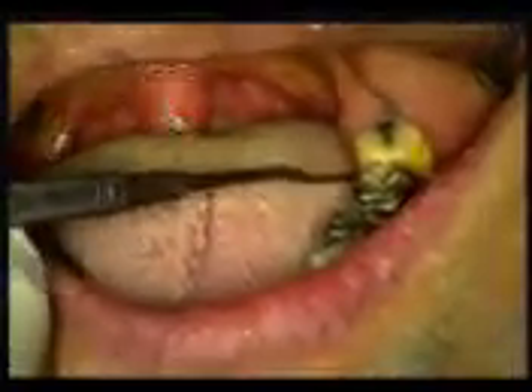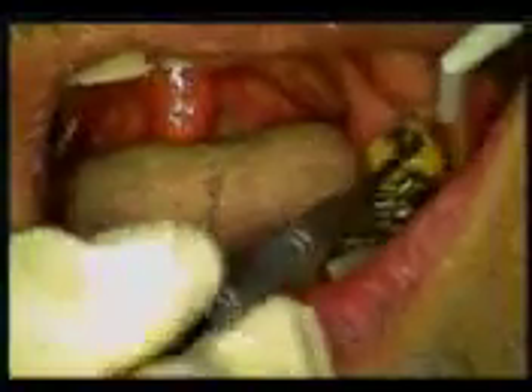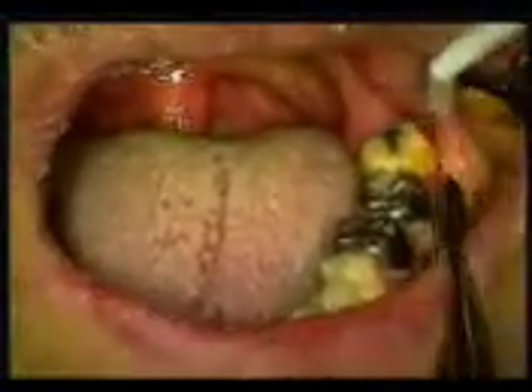I'm using a Woodson WTS-1 right now to try to release the tissue around the neck of the tooth. I like that 45-degree angle on the WTS-1 because it'll allow me to get back around the back. I'm just going down the sulcus, and I'm going to take a 301.